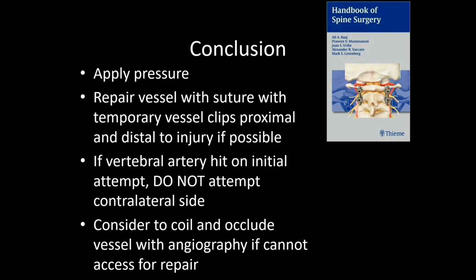If you get the vertebral artery injury, apply pressure. If you can repair the vessel and put some temporary clips, great. That's quite difficult to do in most cases. We've had one case where we were able to repair the vessel on a tumor that I was taking out, and as the tumor came out, the vertebral artery started to bleed vociferously, and I was able to pack it. And at the time, Mac Lawton, before he went to BNI, was with us and came over and stitched it. But I think that's very difficult to do.